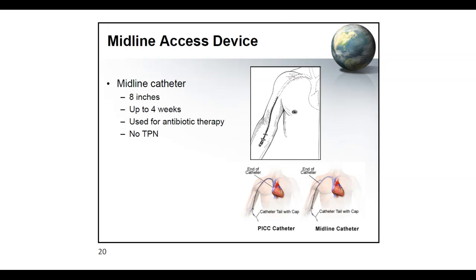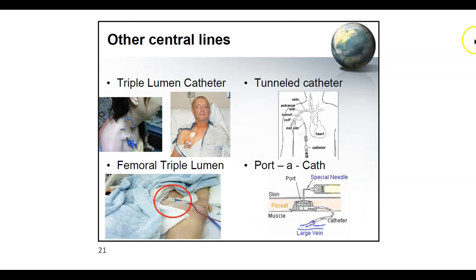All right, as mentioned earlier, there are other types of central lines. Usually you don't really see these as often in your medical, surgical, or even tele floors. You usually can see this in, so let's say your IJ triple lumen. So this is a central line. This usually you will see in the ICU. They usually don't stay long term. This doesn't look like it's a tunneled one, so usually it's used acutely. As you can see here, this has like 3 ports, so that's why we call it a triple lumen central line. And then you have, this looks like a dialysis catheter. So usually it's located in the right chest.